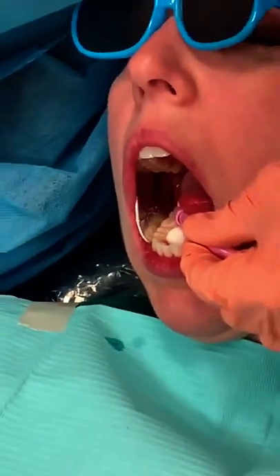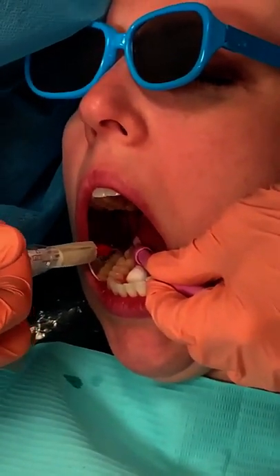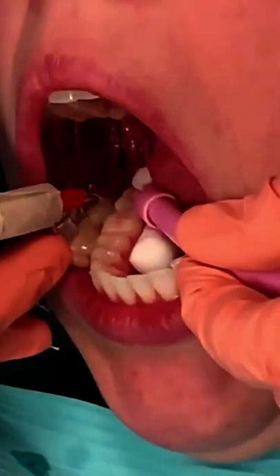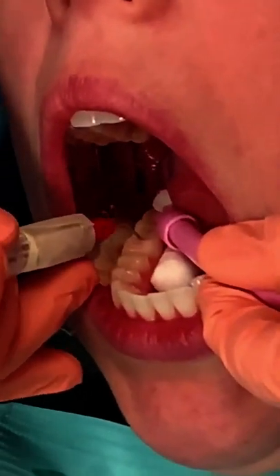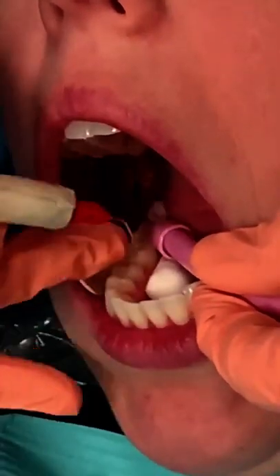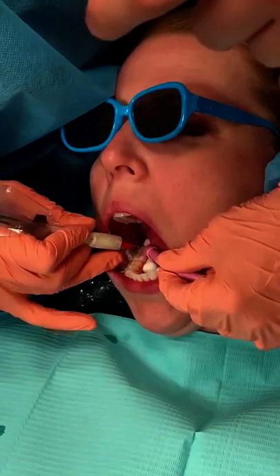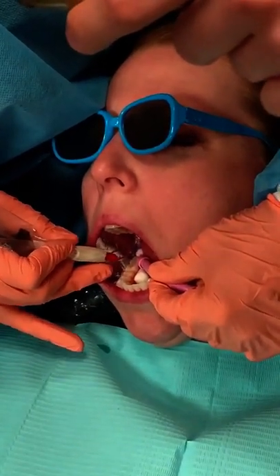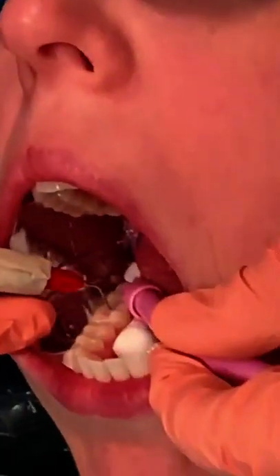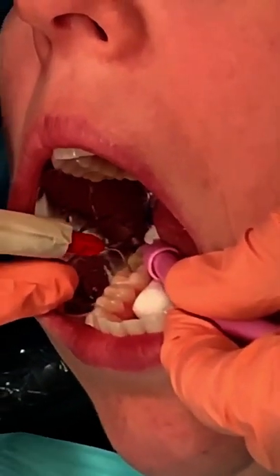I'm going to apply some sealant — I grabbed the Quintro so that you would have a visual. I put a little bit into the occlusal surface there, and then I'm just going to spread it out. I'm going to try to go down the buccal groove. Hers is not very prominent, so I'm really not going to be able to get anything in there. But if the buccal groove is prominent, you do need to get down in that.